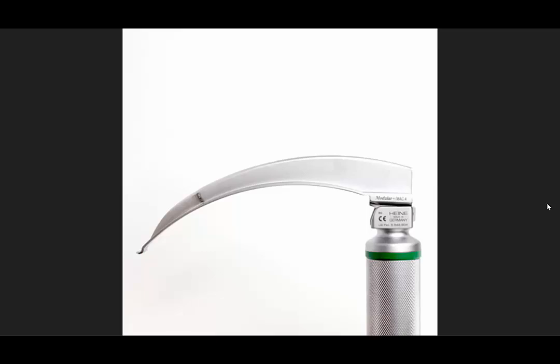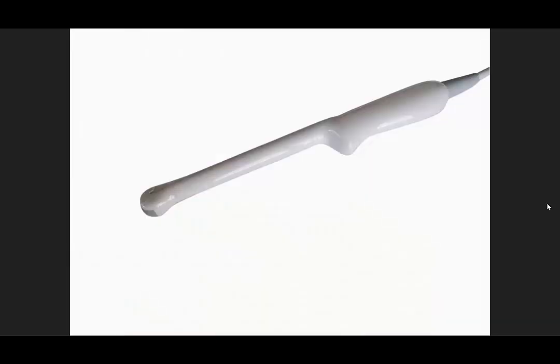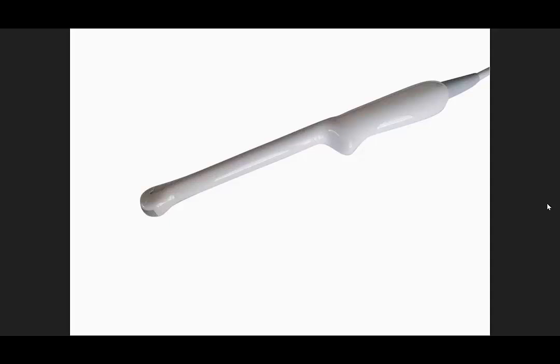Now, when I do these blind, I like to use a Mach 4 blade instead of a tongue depressor. It has a handle on it and a built-in light. There are tons of videos on YouTube about how to do this with a Mach blade. But we can also do it via ultrasound, and once I did this via ultrasound, I have never gone back.